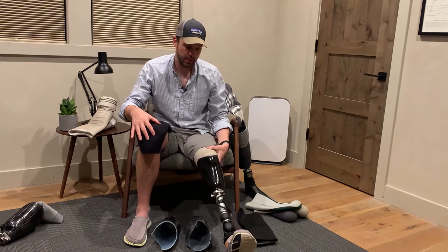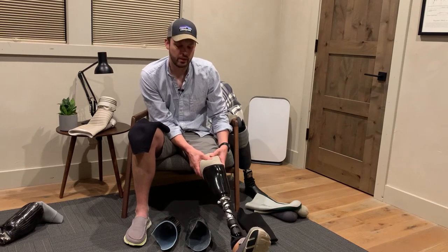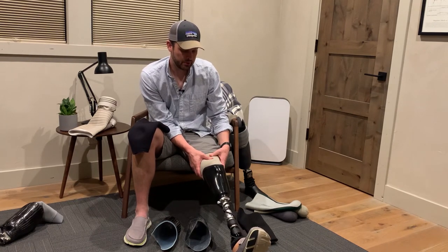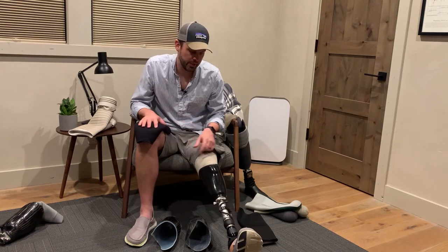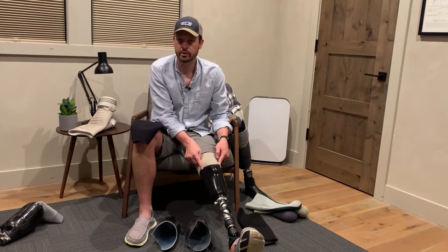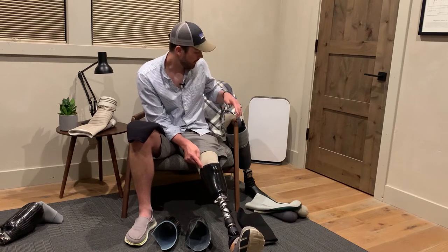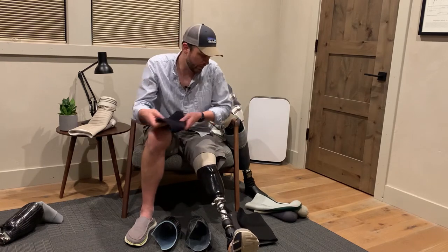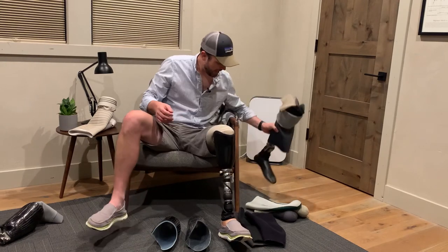Not every system has sleeves, but the sleeves go over the socket and your upper part and give you a suction seal — as I mentioned in the previous episode. The most common issue with sleeves is they rub on the edge of the socket and eventually get holes in them. There's not a lot of ways around that — I'll show you what I've done with my more recent socket.